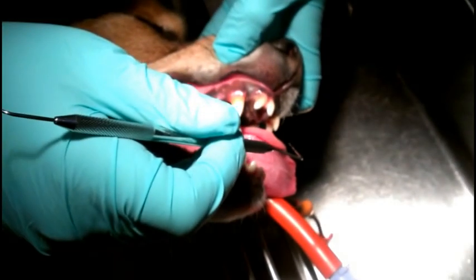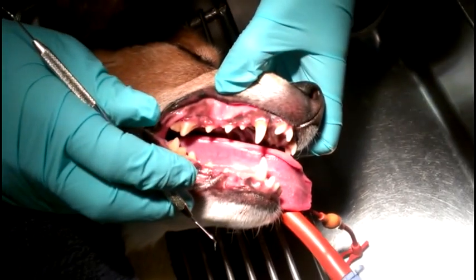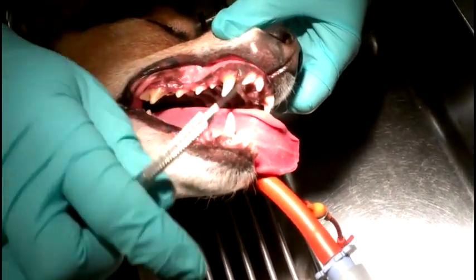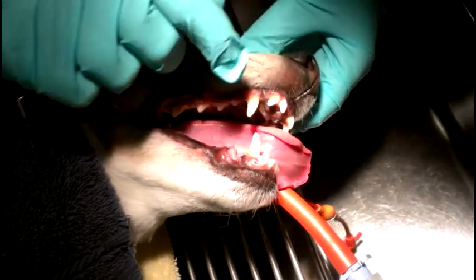First thing we're going to do is start to evaluate her teeth before we start cleaning, just to see if there are any problem areas that we're going to need to potentially x-ray or that we're worried about needing to take out. At a previous dental cleaning, she had these two front incisors pulled. You can see those are nice and healed over.